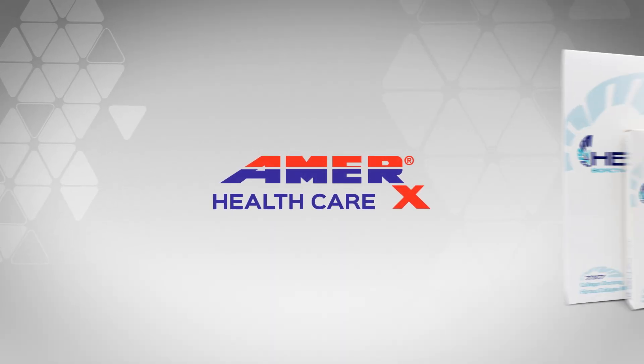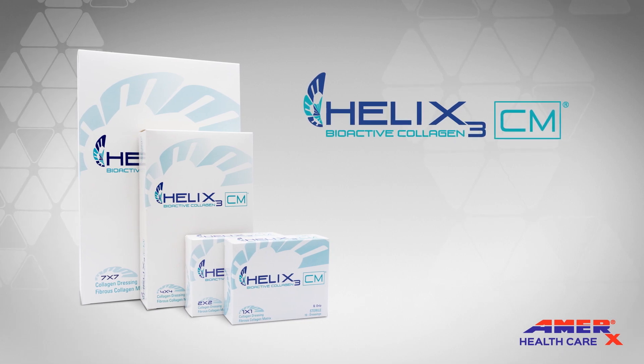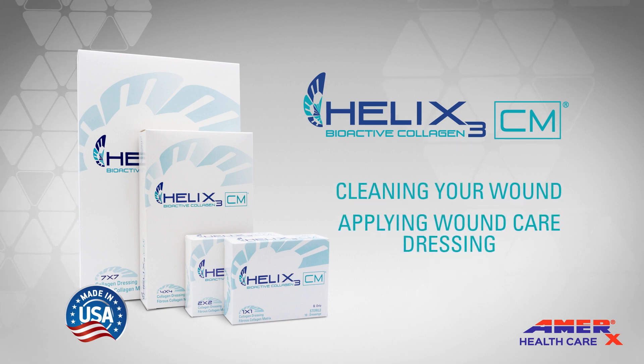Thank you for choosing Helix 3 CM Collagen Matrix from Amerix Healthcare, which is proudly Made in America. This video will assist you in cleaning your wound and applying your wound care dressings.